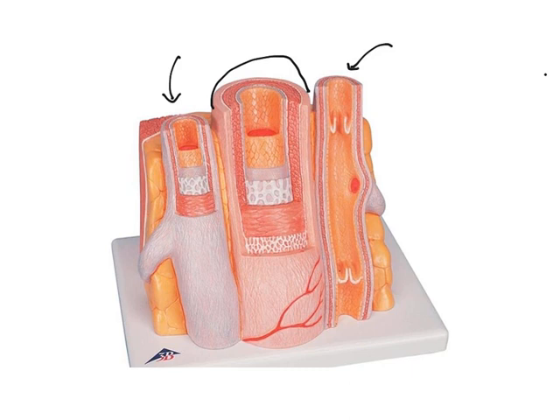Now, the blood vessels have three distinct layers. The innermost is called the tunica interna or intima, and that in the artery consists of the endothelium. I'm just going to label it as E, which is that orange. Same as in the veins. Okay, so here we'll just cut it open so you can see. So the endothelium. Then beneath that is the subendothelial layer. So I'm just going to abbreviate it as SE.